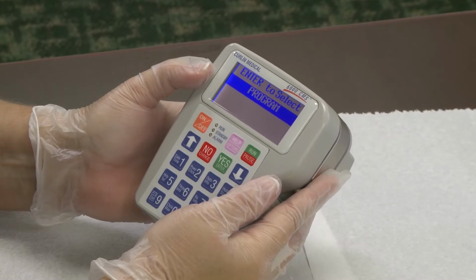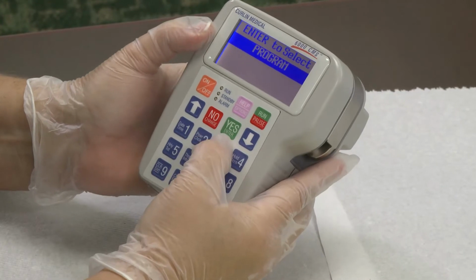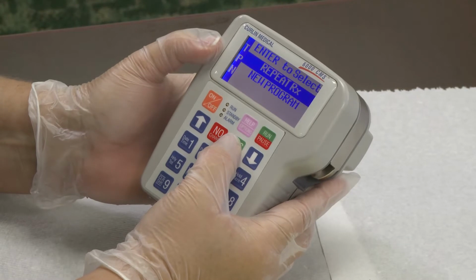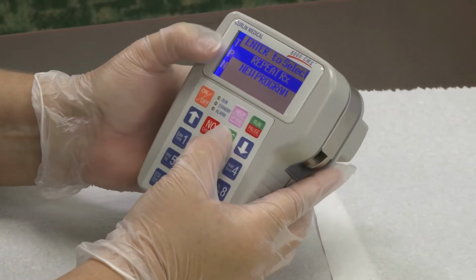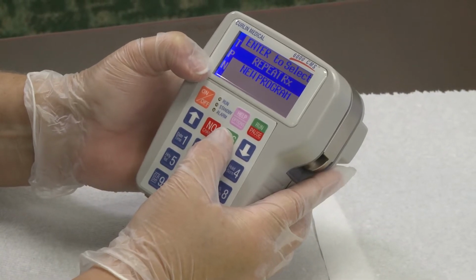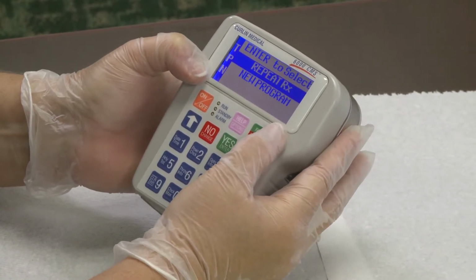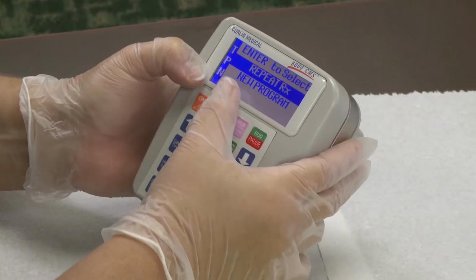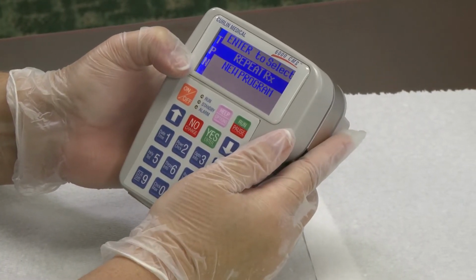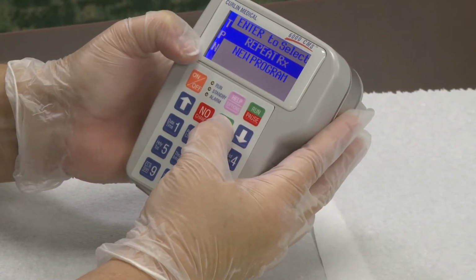The first thing that comes up, it says enter to select program. Enter and yes are the same button, and we're going to hit yes to program. It says we're in the TPN mode for programming on this pump. It does other things, but we're using it for TPN today. It says enter to select. Repeat RX is already blue or highlighted versus new program under it. You will never put a new program in, the pharmacy will. So we're going to say yes or enter to repeat RX.